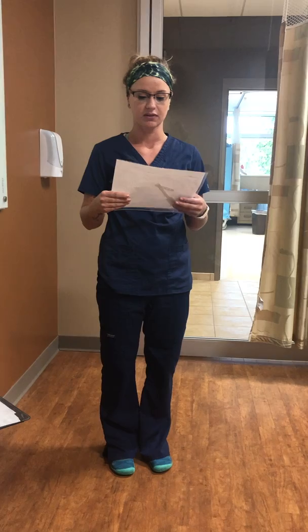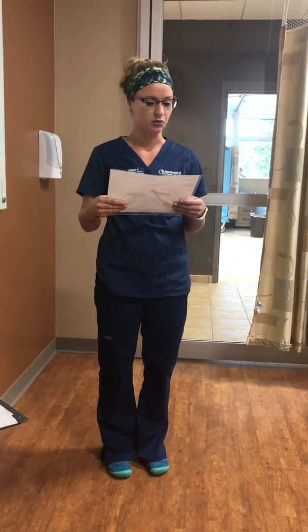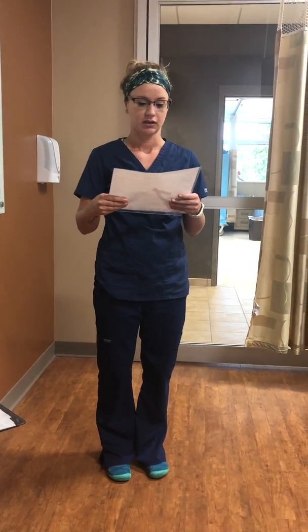Hi, I'm Jenny. I will be demonstrating an NG tube insertion. I am outside my patient's room looking at their orders, and my patient is Jennifer Doe, date of birth 11/5/1975. She has no known drug allergies, and she has a new order placed for an NG insertion. She has a bowel obstruction, and that is the purpose of the NG tube.